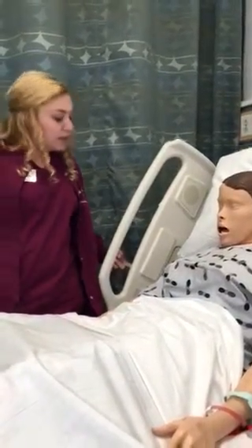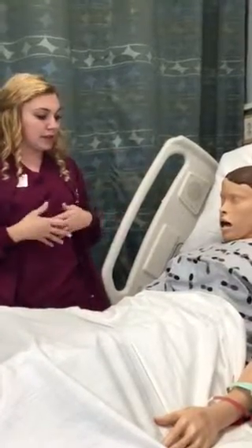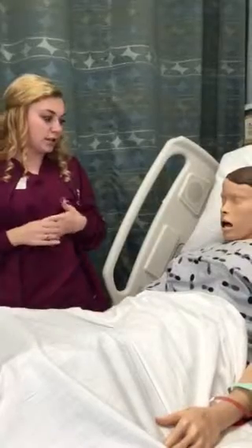So I'm just going to put this tube in your nose, and it's going to go down to your stomach, and it's going to kind of release some of the pain and pressure in there. Okay.